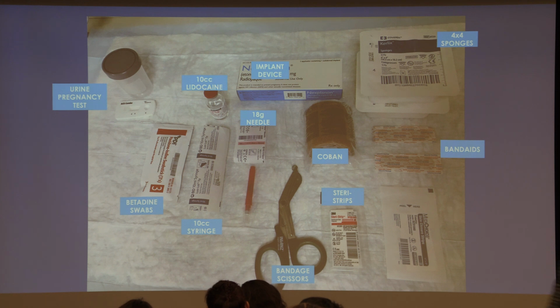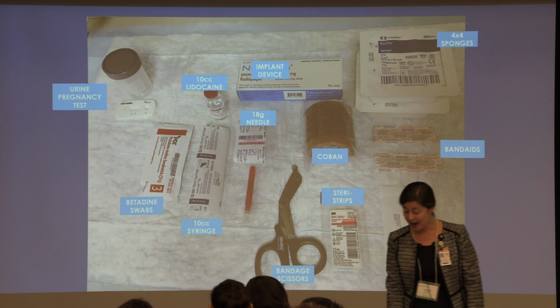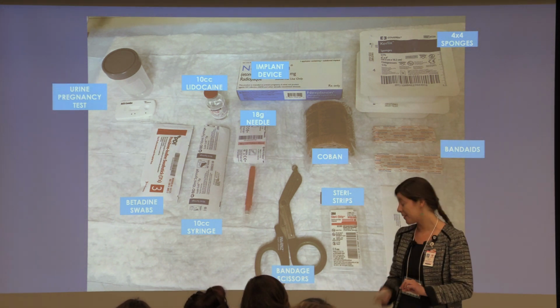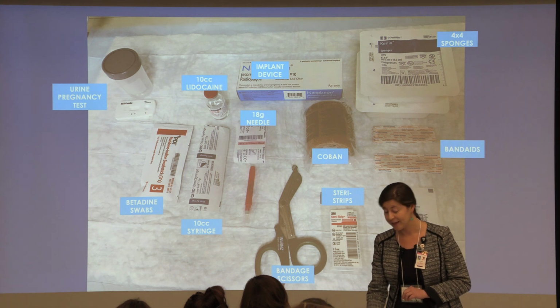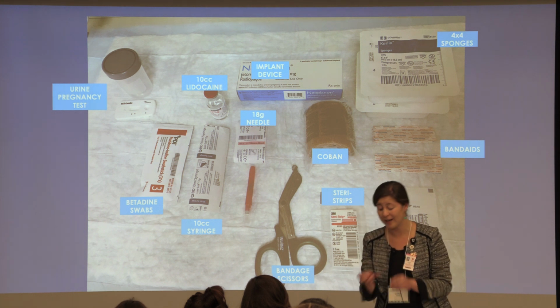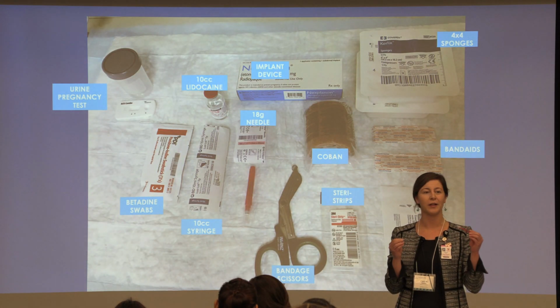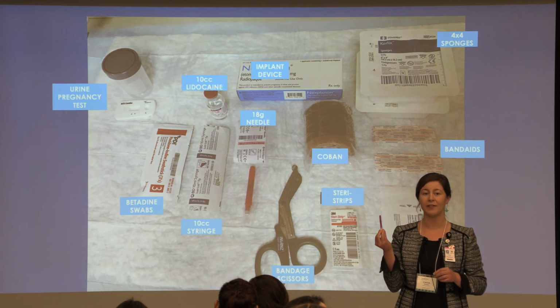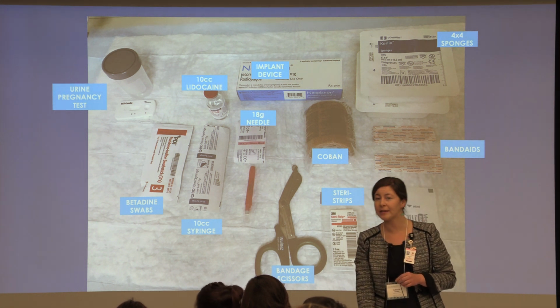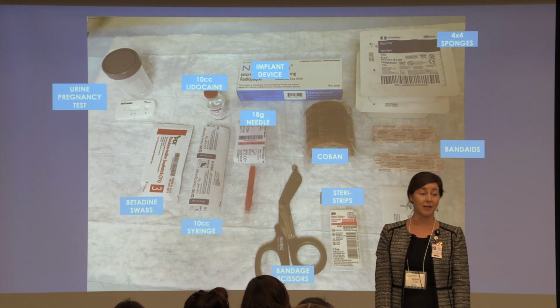So, again here, our cassette, our urine pregnancy test, our iodine, our betadine swabs, just our syringes, needles. Again, I know that's kind of scary, a spinal needle in your arm, but that's what we've called it. 25 gauge, 1 1/2. Lidocaine typically is just plain lidocaine, 1% plain lidocaine without epi.